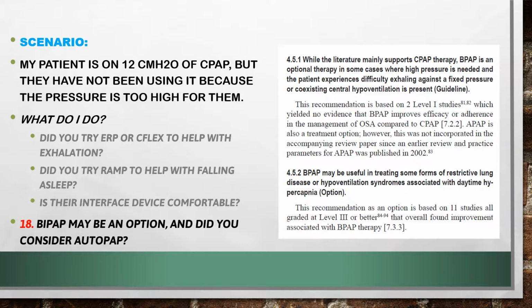And it goes on, we're going to skip ahead to the APAP. APAP stands for AutoPAP. So AutoPAP is also a treatment option. However, this was not incorporated in the accompanying review paper since an earlier review and practice parameters for AutoPAP was published in 2002. So what they're saying is AutoPAP really hadn't been established and reviewed by the time that these rules were made, so AutoPAP might be a consideration to try for this patient.